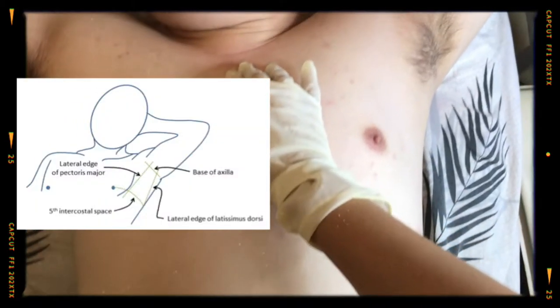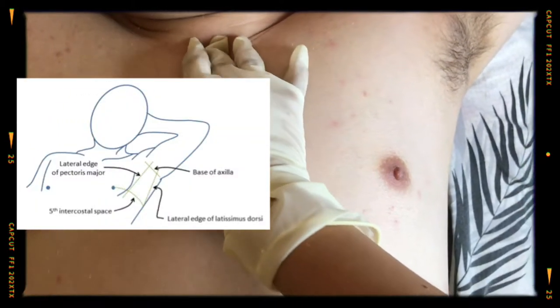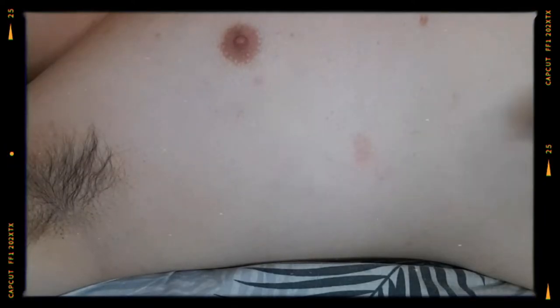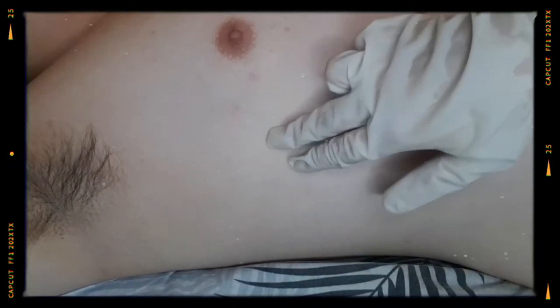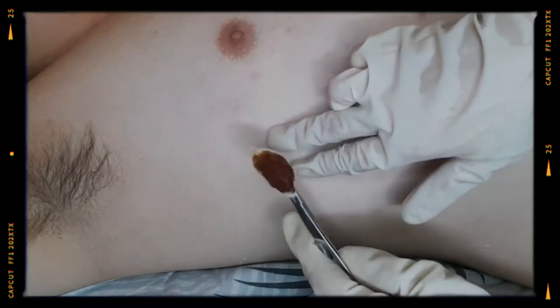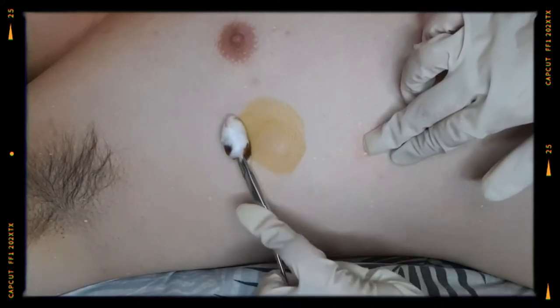For the procedure, if possible, have the patient assume a semi-upright position with the arm placed above the head. Prep the skin over a wide area of the chest wall with povidone iodine, starting from an inward to an outward pattern.